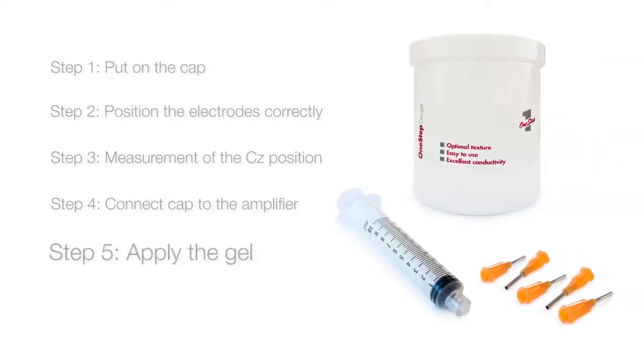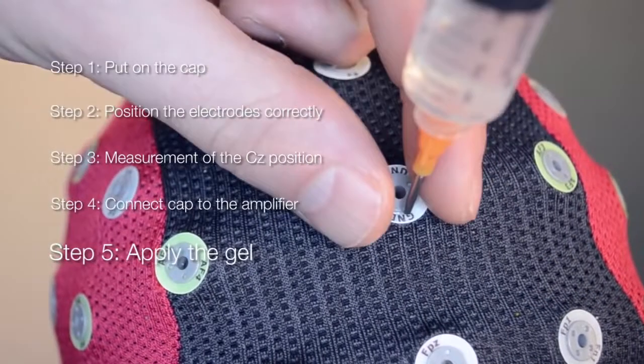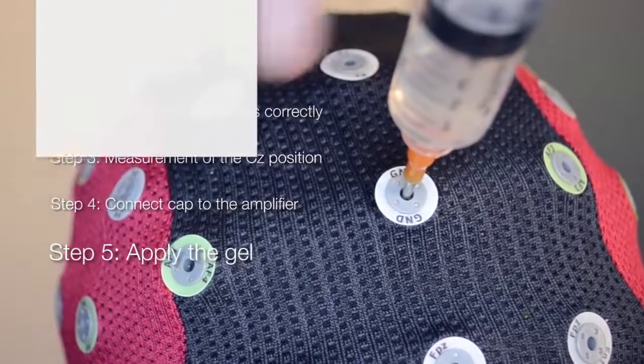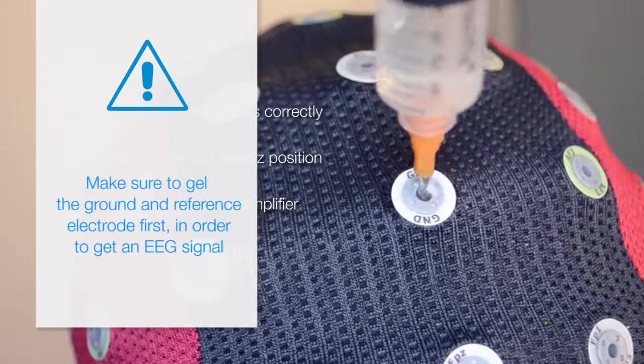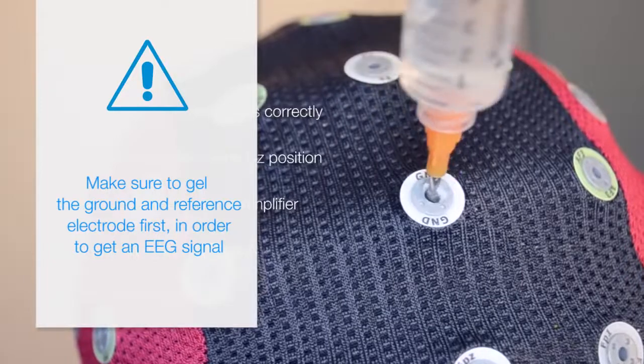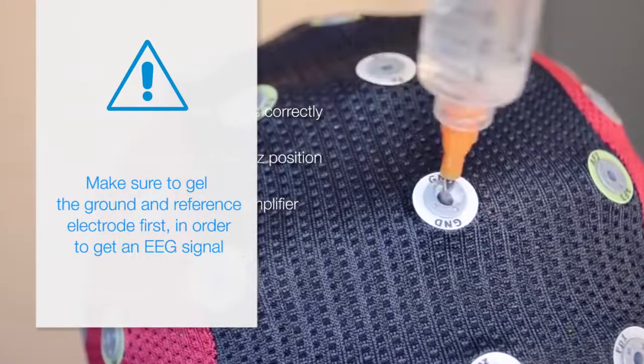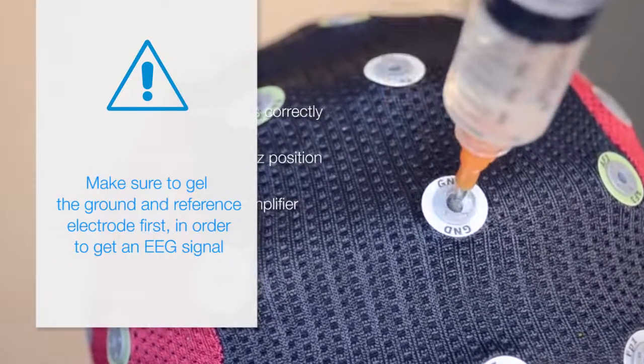Apply gel using a dedicated syringe. Blunt needles allow for easy insertion of gel through the hole at the top of each electrode. Fill the syringe with gel and inject a small amount through the hole in each electrode. Apply the gel with a circular hand movement. Continue the flow of gel as the needle is withdrawn to ensure that the electrode cup is fully filled.